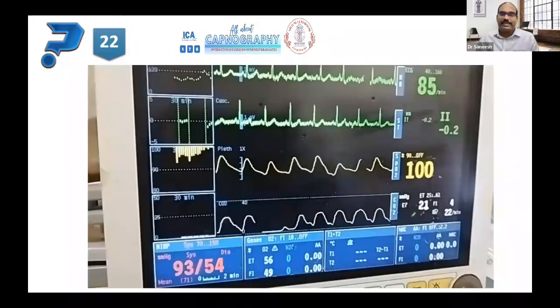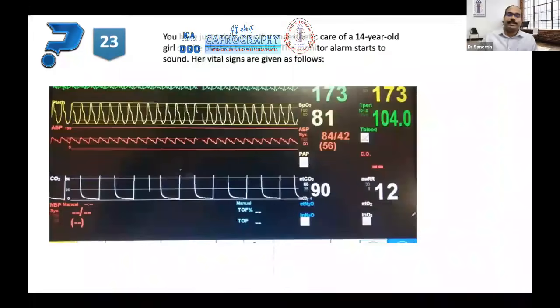No? Okay, for laryngeal surgeries, you can't get a reliable EtCO2 because of this sampling issue, because it's very high flow going into the airways. If you are very particular and want a reliable PCO2, do a blood gas. If you are working in a very good infrastructure setting, you can have transcutaneous carbon dioxide monitoring. I'll show the picture later.